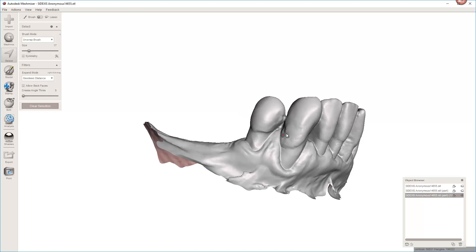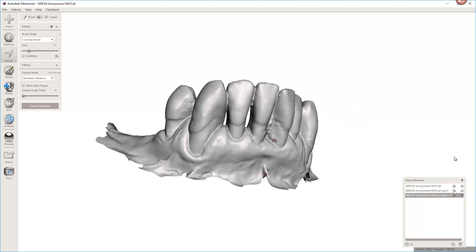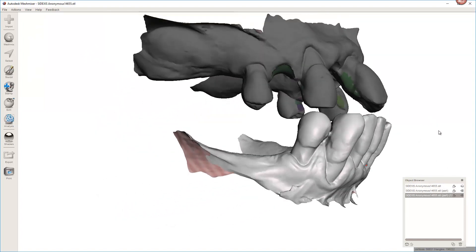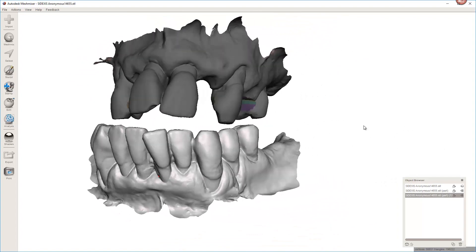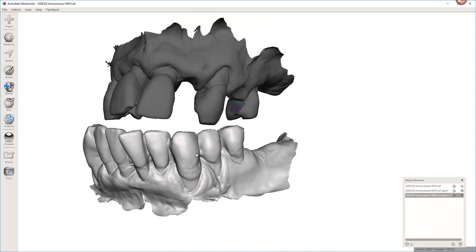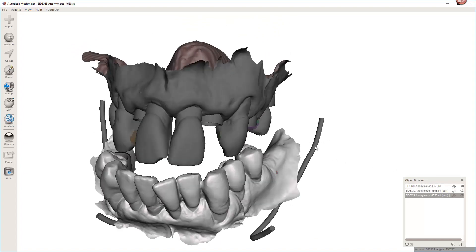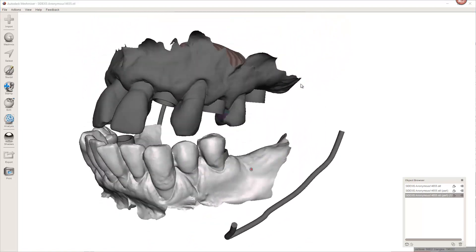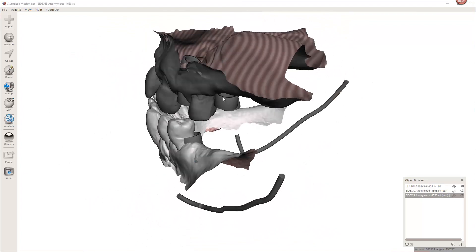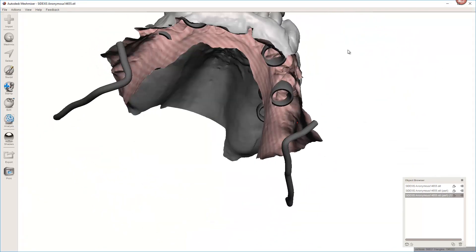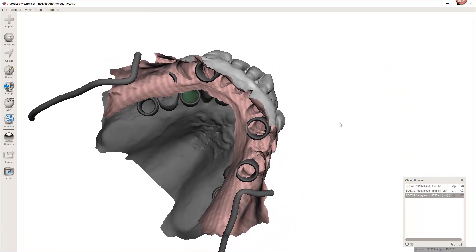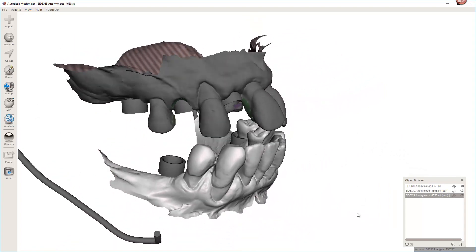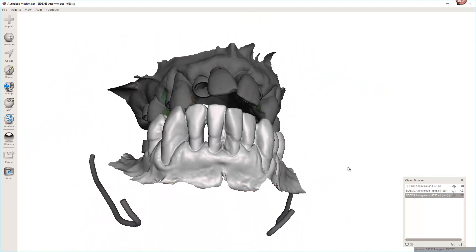And this is the case that I am doing upper, lower, all on 6 upper, all on 4 lower. And so I've already extracted teeth on the top and I am now going to extract the lower. The little thing I like to do is I actually extract the guide tubes with the model and that way I can sort of see where I need to extract.